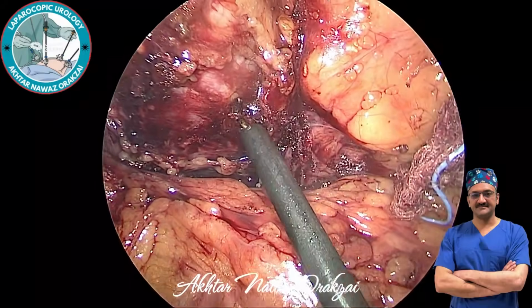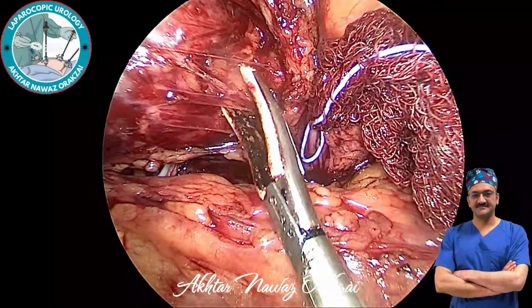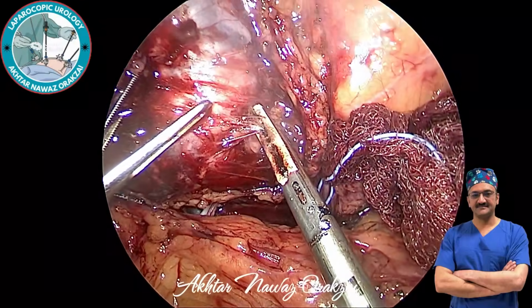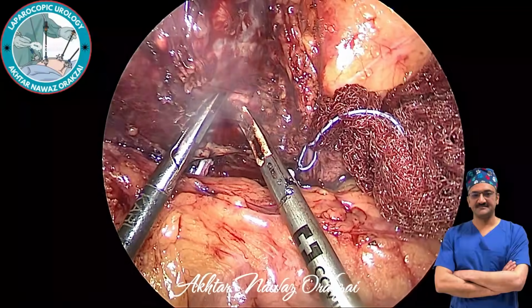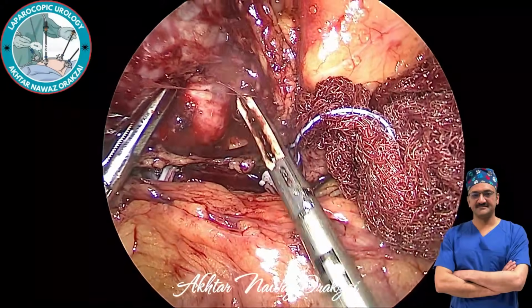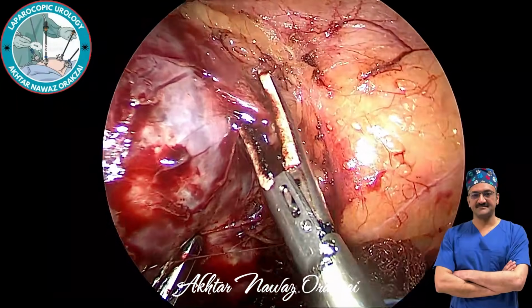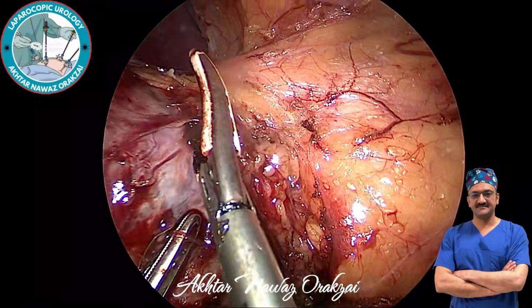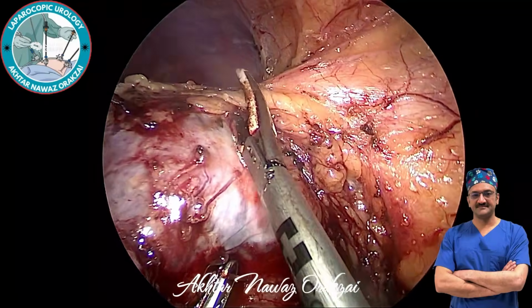So dissecting close to the gland so that that artery is not injured, and also keeping in view that the tumor must not be opened, because we don't know, it is not pheochromocytoma, so it might be some malignant mass.